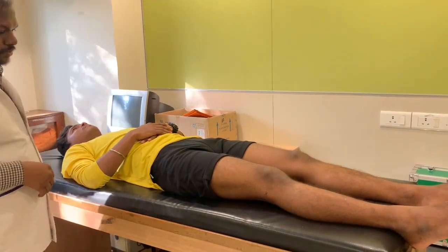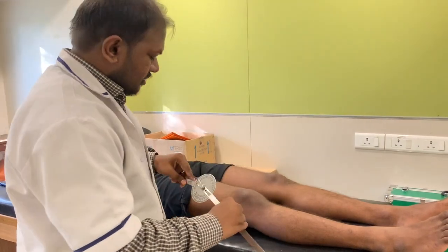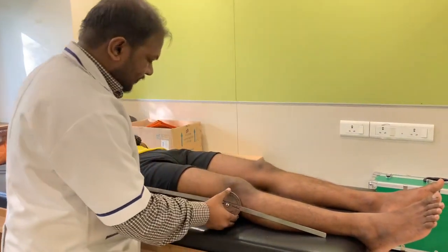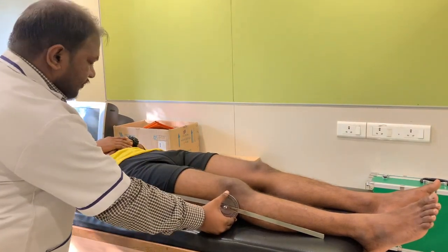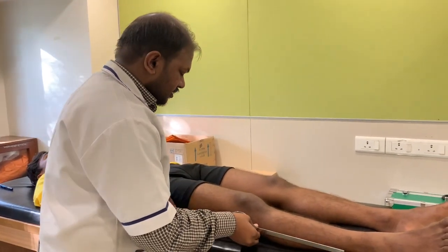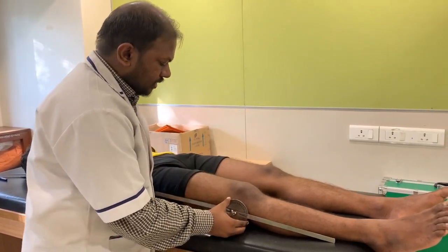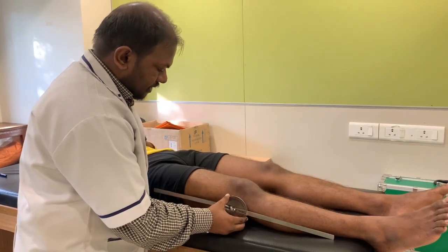Once I have marked the point, the fulcrum should coincide with the point which has been marked over the lateral epicondyle, here on the lateral aspect of the knee.